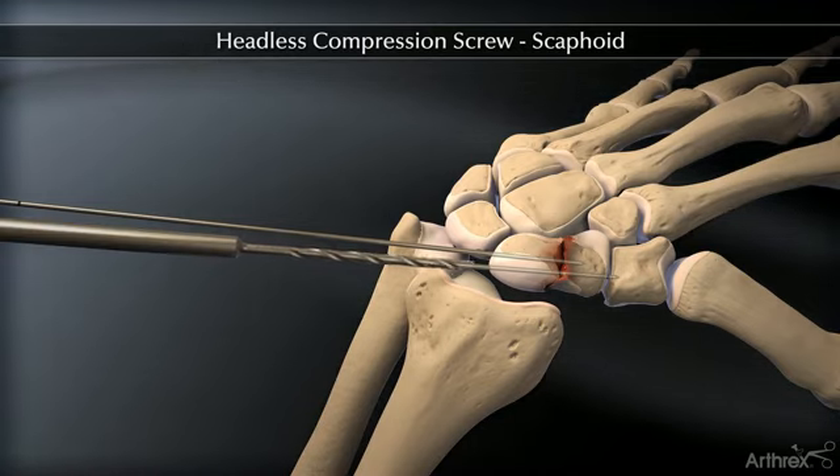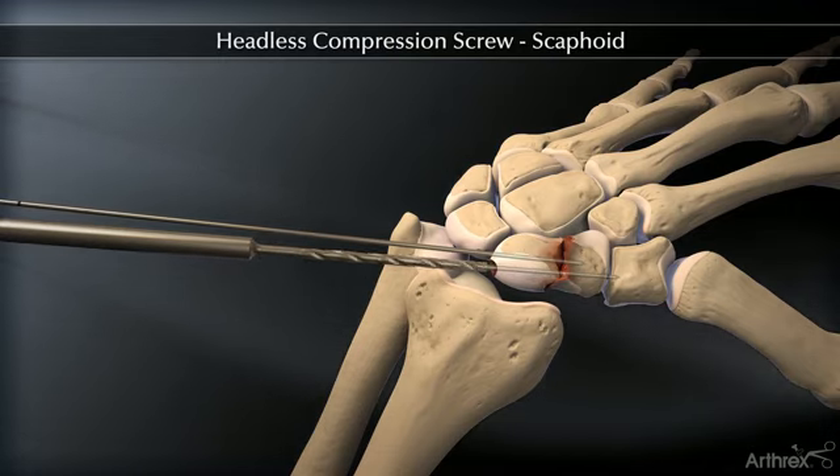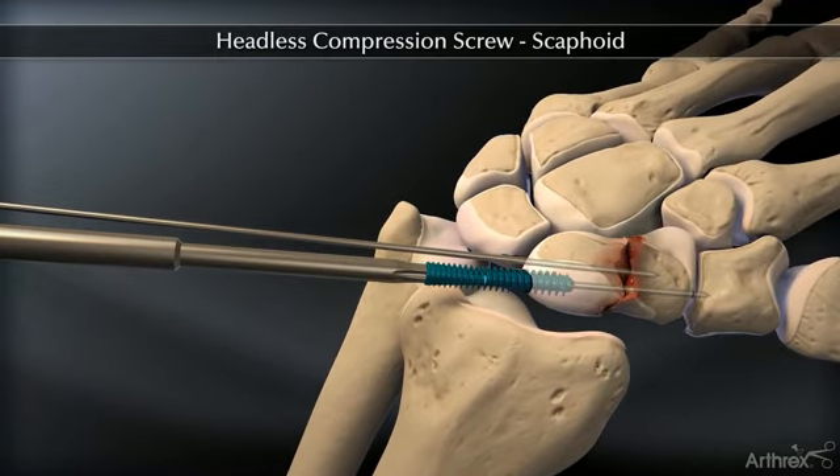Next, drill into the far fragment with the long drill. Insert the correctly sized screw with the appropriate driver.